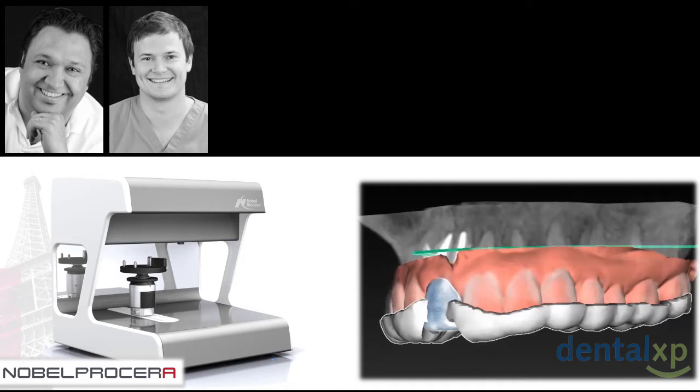And you know, guided surgery has known a real revolution very recently that just few people noticed. The revolution is that you can now merge the data from a lab scan to the DICOM file of your patient. It doesn't seem to be a big deal if I just told you that, but believe me, this is a real game-changing process because we can now produce teeth-supported surgical guides that will fit perfectly for all your single and partial cases.